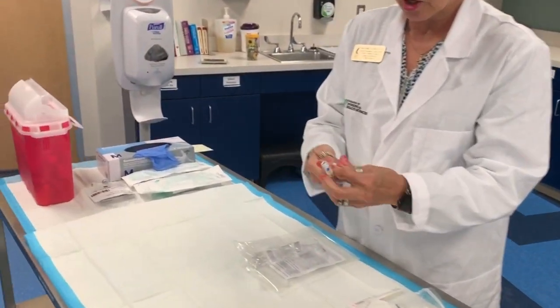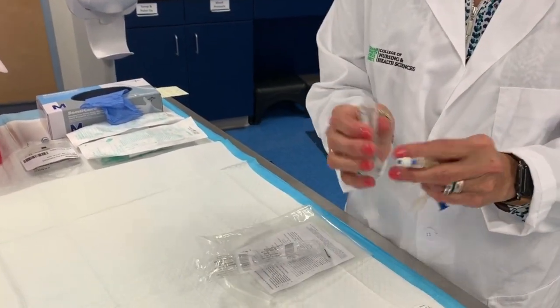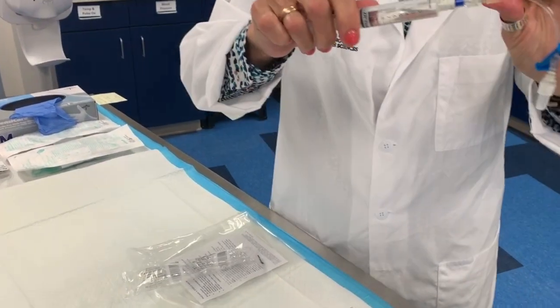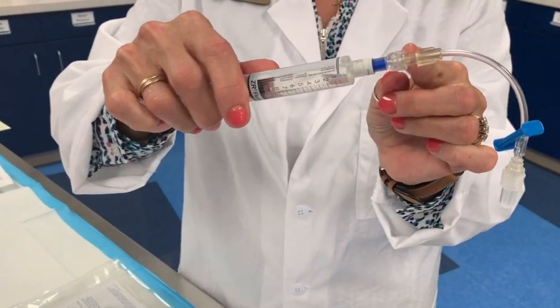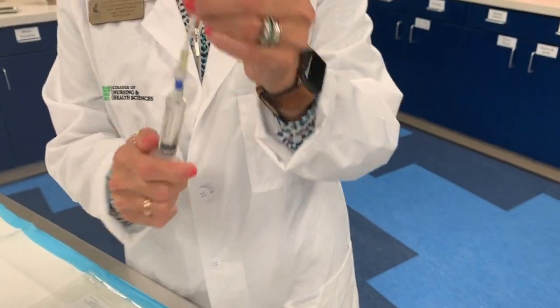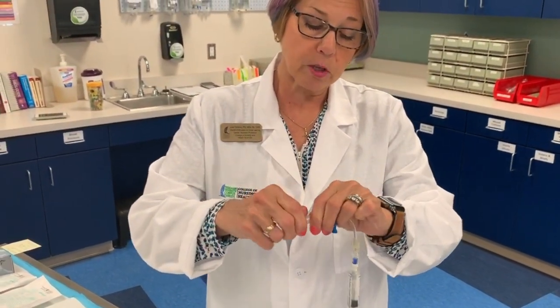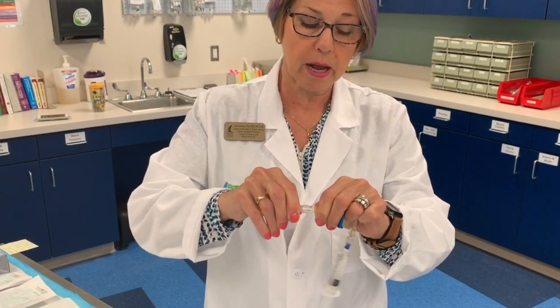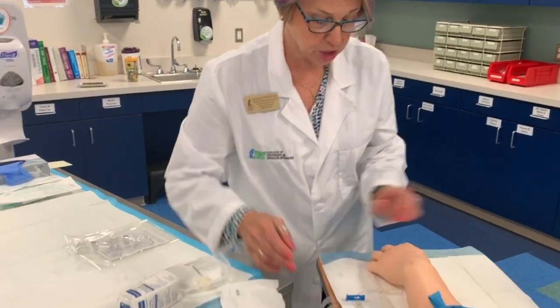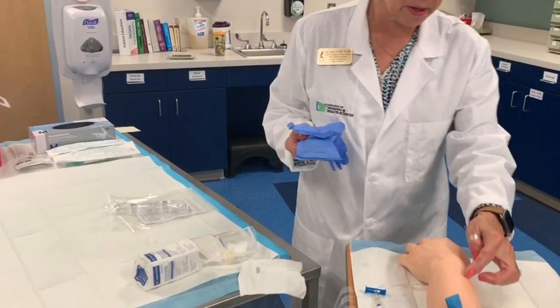Remember, you want to keep your edges sterile, so you want to not touch the tip of either one, and then go ahead and flush this. Always make sure you check this connection here. Oftentimes in the package, it's a little bit loose like this one was today. So you want to make sure you tighten it so we don't have any problems. I also like to loosen the cover here, so after I've started the IV, it's a little easier for me to get to. And I place it right next to my patient. Okay, so now we're ready, and you can see I've got a nice vein that's popping up on the forearm.